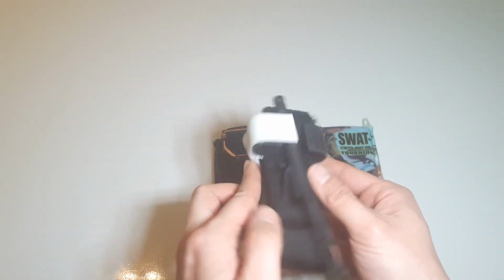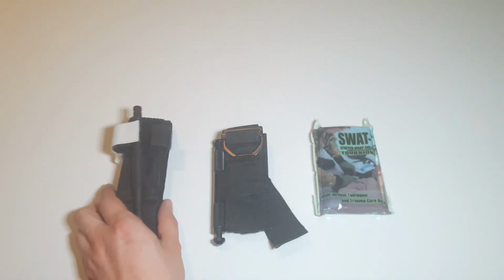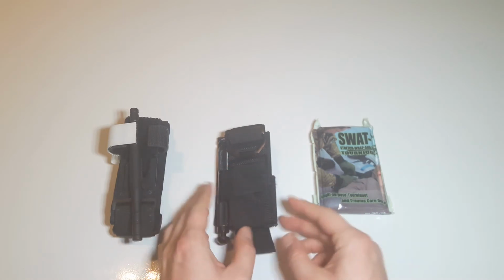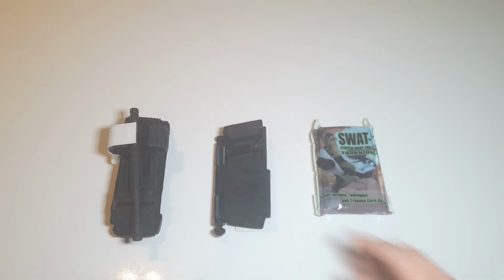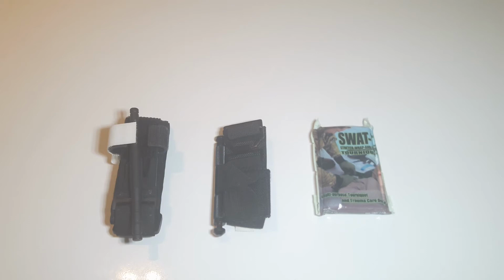Which brings me to my next point. Both of these tourniquets have a lot of fake or imitations out there, so you have to be careful. If you want to be sure, you should get it directly from the maker. Another YouTuber by the name of Skinematic demonstrates how they don't work as well as the real ones by forcing you to twist the windlass many more times than the authentic versions to stop arterial flow. And in another video, he shows how to identify if they're fake. I got mine from Amazon from a surplus military IFAK kit, and I'm certain this is real. The materials, the finish, and markings are all where they should be.